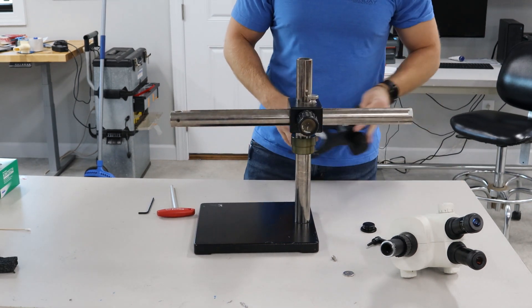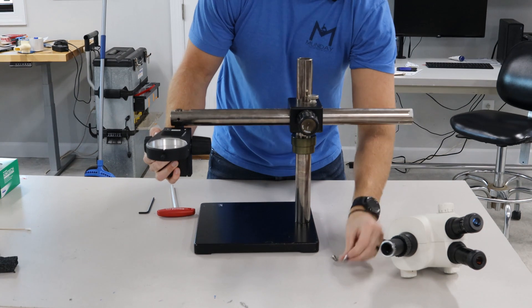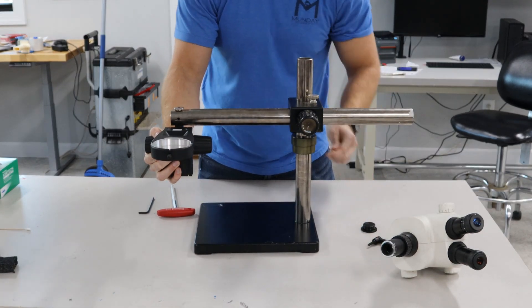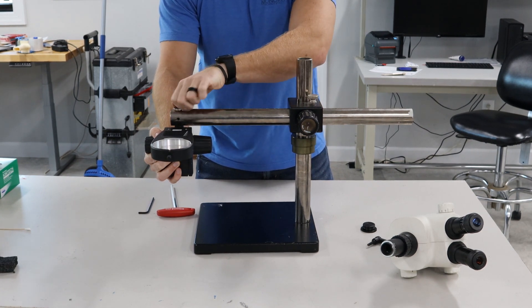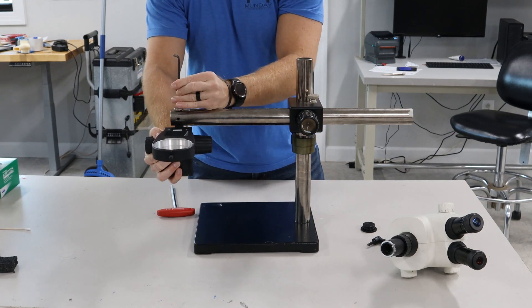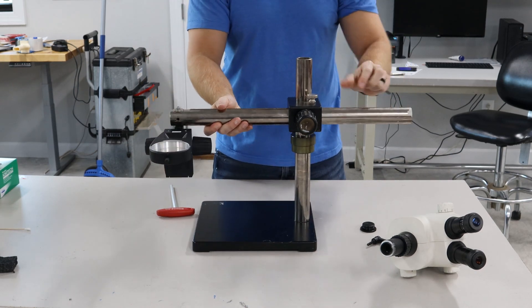Once that goes on, you've got to put your focus assembly in, or your pod carrier. You will grab your washer and your screw, and then your four millimeter allen wrench to tighten it down. When you tighten this down it's still going to be a little loose — it's going to be free swinging.